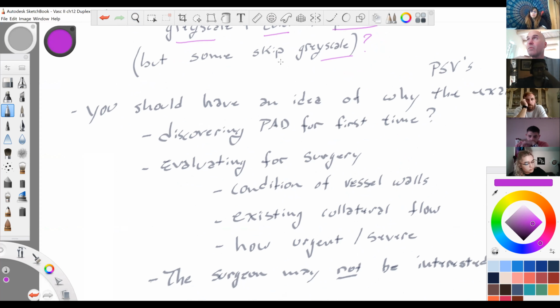Oh, that was the other thing. These are really long exams. So you got to concentrate on not making them longer than they need to be. So if you start off with triphasic flow and you're inching along every centimeter, taking another scan and looking at it, that's probably a little bit too much. You need to jump to the next location, the next required image, take that.